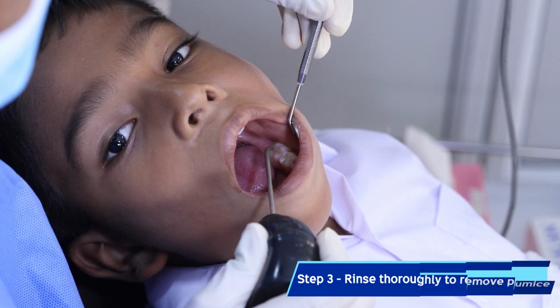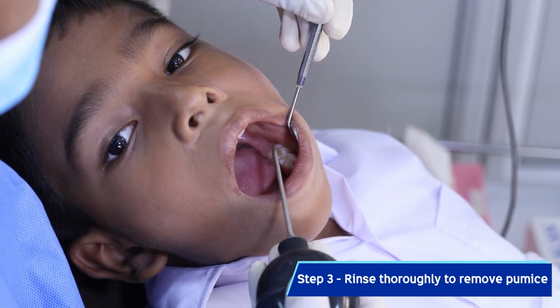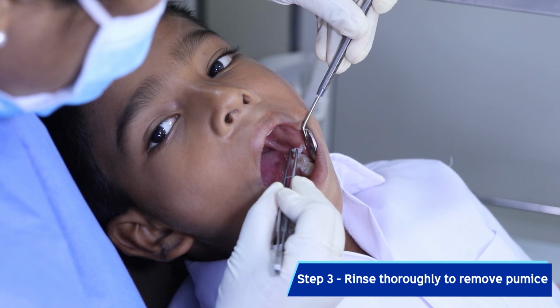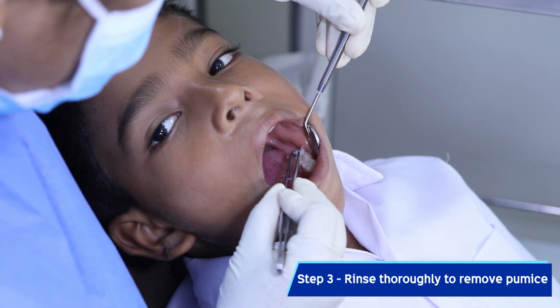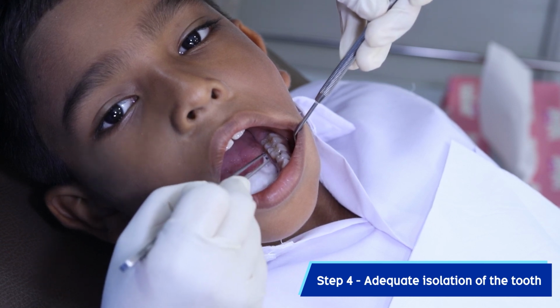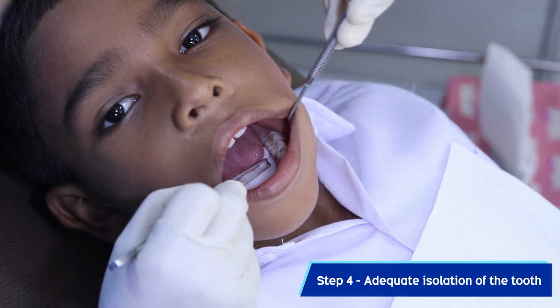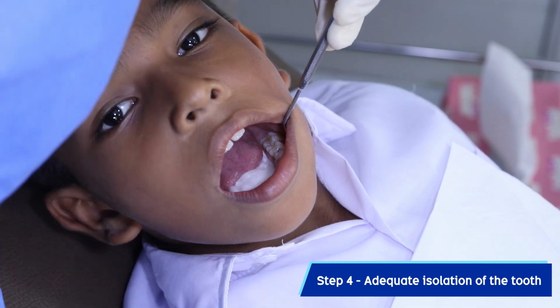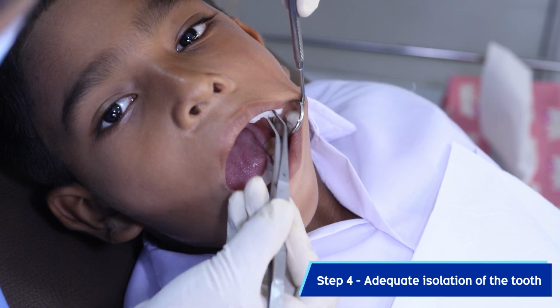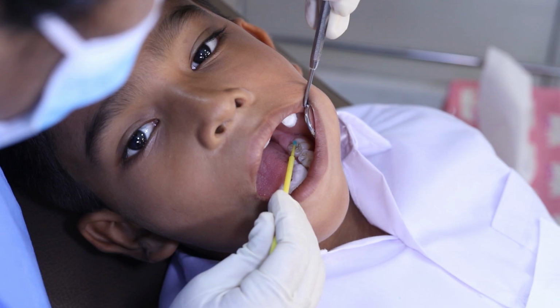Rinse the occlusal surface using a chip syringe and wipe with a moist cotton pellet to remove any remaining pumice. Isolate and dry the tooth surface. For better retention, proper and adequate isolation is mandatory. Properly block the submandibular, sublingual and parotid salivary gland duct openings.